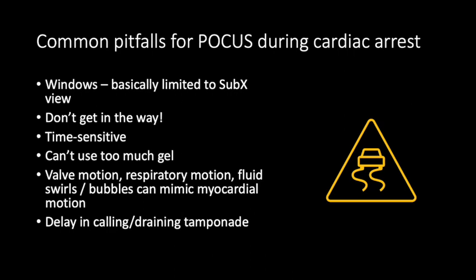Also, this is something that a lot of people don't think about, but you can't use too much gel, especially on the chest itself. The reason is that if this patient is going to get shocked, ultrasound gel is able to conduct electricity. Depending on how much gel is on the chest, it can disrupt the normal flow of electricity through the patient's heart and body, and instead direct it through the skin and through the gel itself, which will eventually result in ineffective defibrillation. So that's kind of a unique finding.